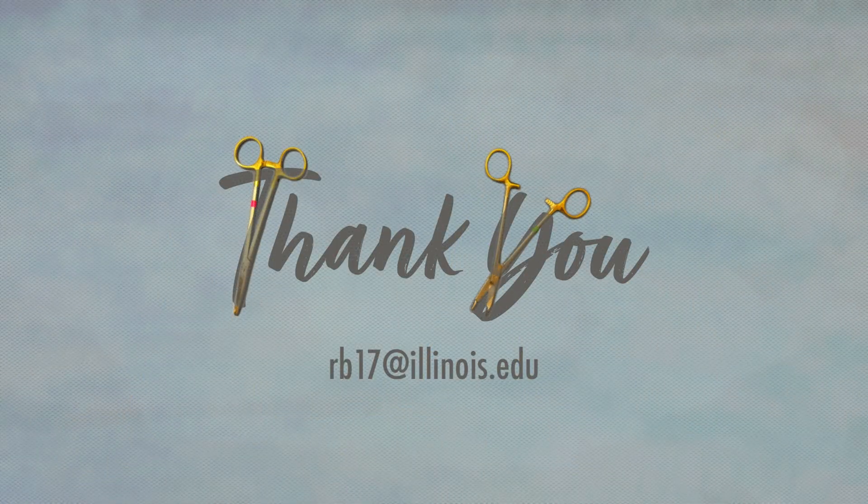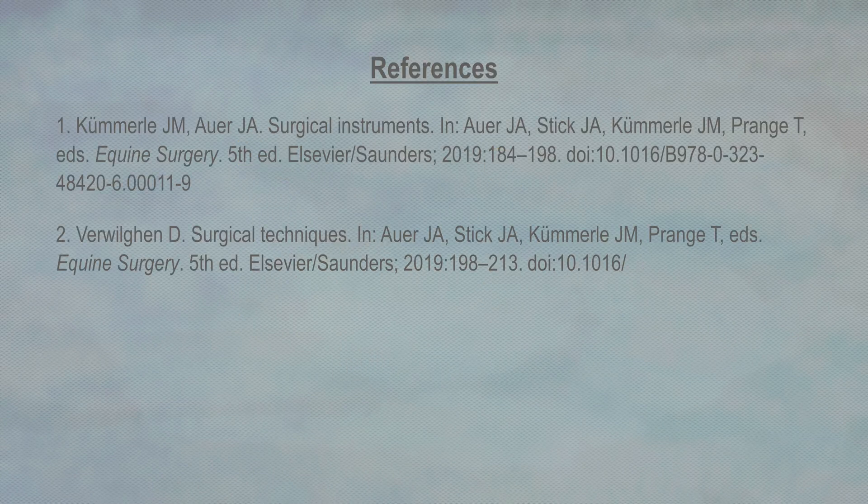I hope this video has been useful to help you better understand how handedness affects surgical instrument use, whether you operate left-handed or if you work with left-handed assistants and trainees. I find it very useful to be comfortable using surgical instruments in either hand, and I encourage all trainees to practice until subconscious muscle memory is developed for both hands. Thank you.